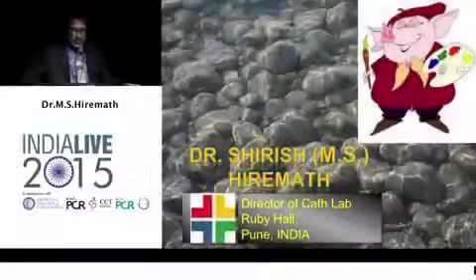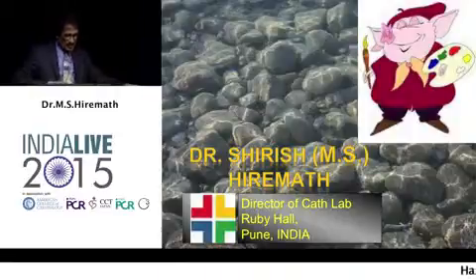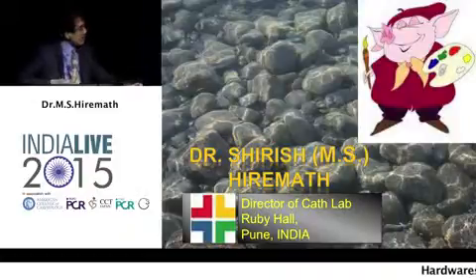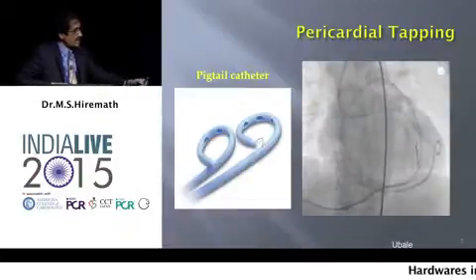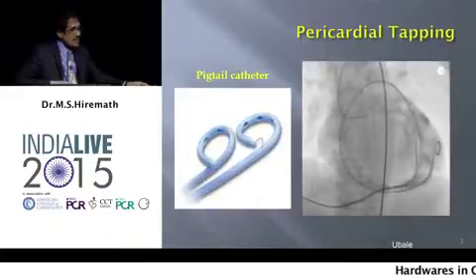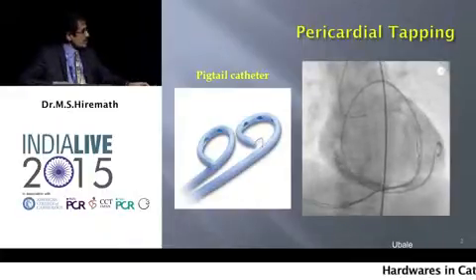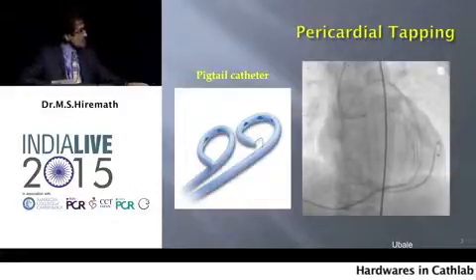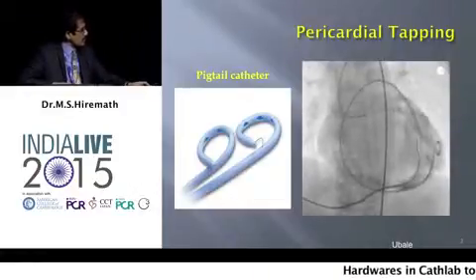And if I continue to show you lots and lots of cases of angioplasty, it won't look nice. So I thought I will show you the way we can prevent complications in the cath lab. This is a common scene. Once you have a perforation, you need to know how to put the pigtail in. So everybody must know how to get a puncture quickly.